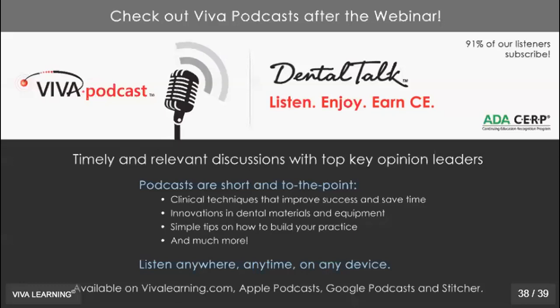Kathleen, is it okay to place instruments into cassettes before putting them into an ultrasonic? The answer is yes. Ideally, that is the best solution. Ultrasonics and cassettes are designed for the sound waves to permeate all of the little cracks and crevices and holes within the cassette to get to every instrument surface. By doing that, you are handling these instruments less and less, and that's what we want to promote. We want to promote less manual handling of contaminated instruments. So yes, do that.